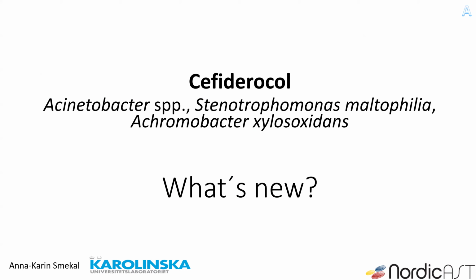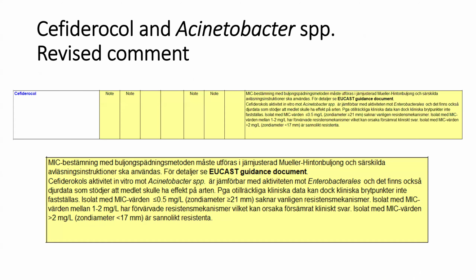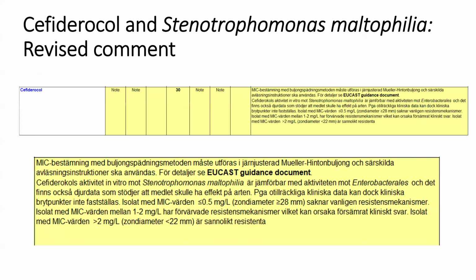Sorry about that. Okay. Then let's go on with the cefiderocol, and then we have some news. We can go to the next slide. For cefiderocol and Acinetobacter species, the comment is revised, and also the tentative clinical cutoffs in the comment are revised. So please read this with caution. And the same goes for the next slide, where we have cefiderocol and Stenotrophomonas maltophilia, where the comment is revised, as well as the tentative clinical cutoffs you can use.